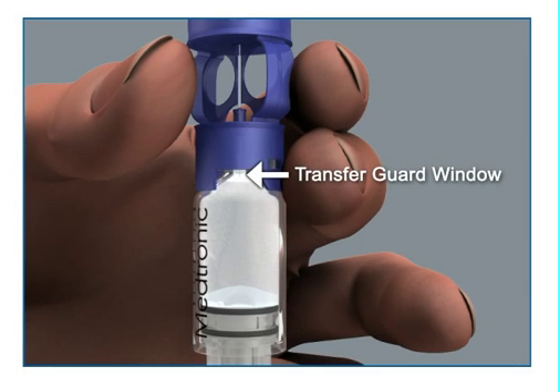Look in the window of the blue transfer guard to make sure no air bubbles remain. Any bubbles the size of champagne bubbles are normal, so don't worry about these.